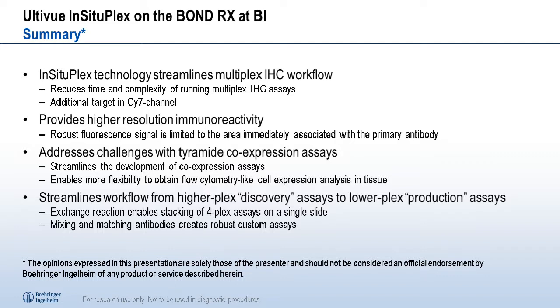In addition, the signal that we develop provides higher resolution immunoreactivity. That signal seems to be limited to the area immediately associated with our primary antibody, and this may open up some avenues and some applications where we can now evaluate with more confidence subcellular localization of specific targets.